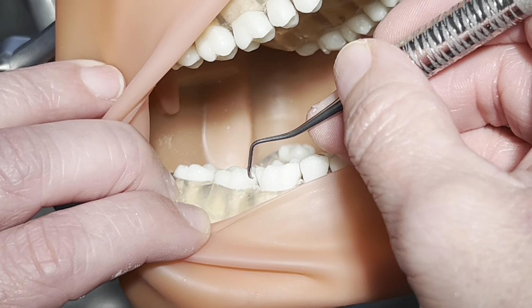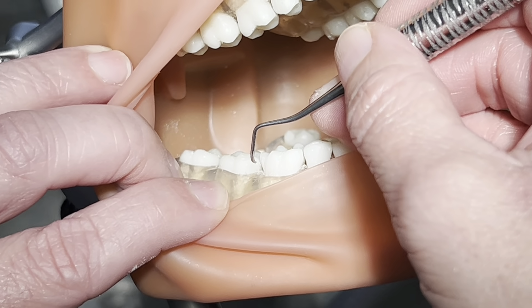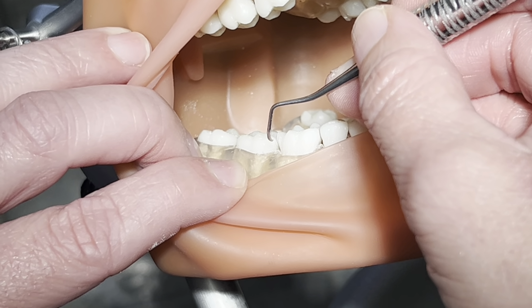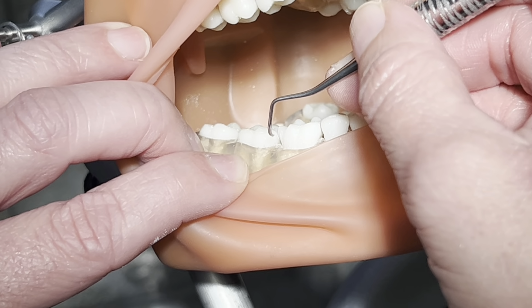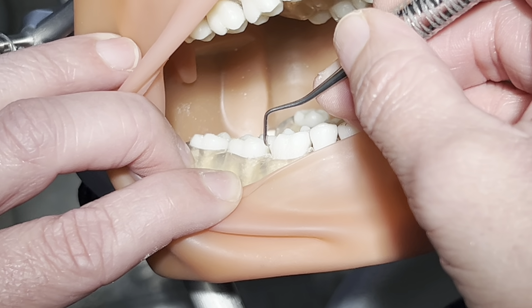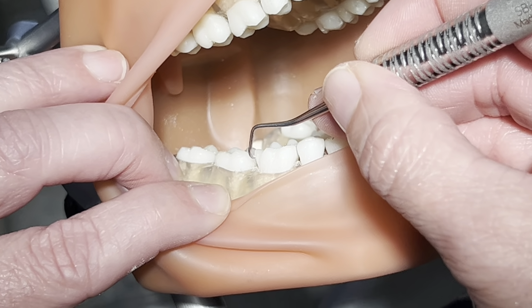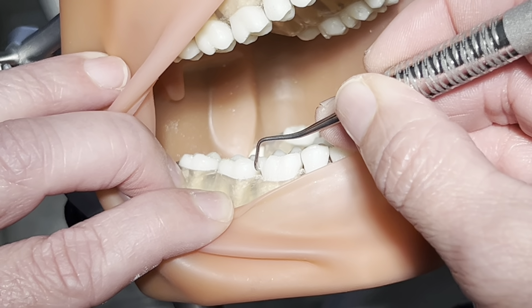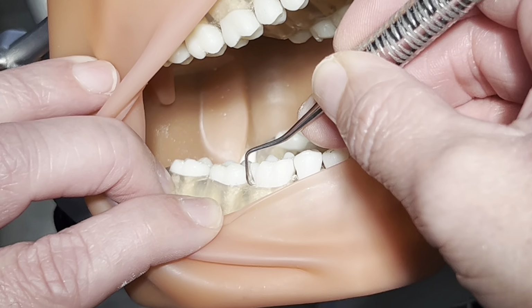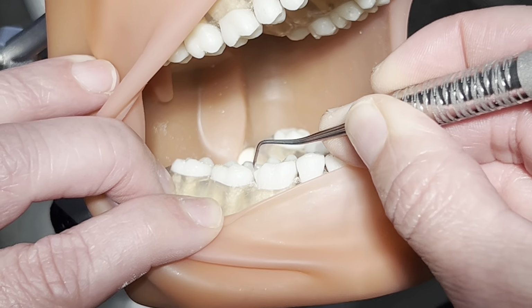The last part of the lab activity asks you to perform a calculus removal stroke using a Barnhart 5-6 on a posterior tooth, and perform an assessment stroke using an 11-12 Explorer on an anterior tooth. For the posterior tooth, we are on the buccal of quad 4 using that Barnhart, and we're going to apply the things that we've learned. So the short biting stroke with the correct angulation. So you can check your angulation again, 90, close in at 70 to 80, and your short biting stroke.